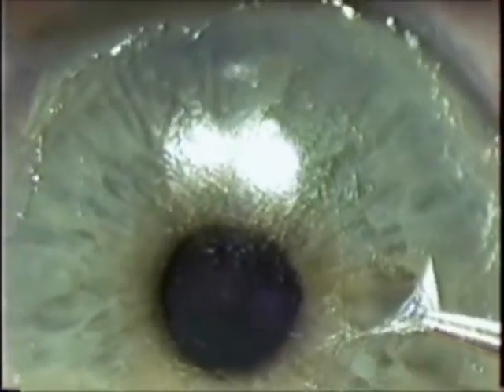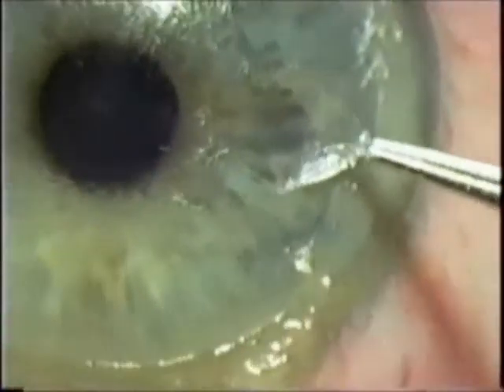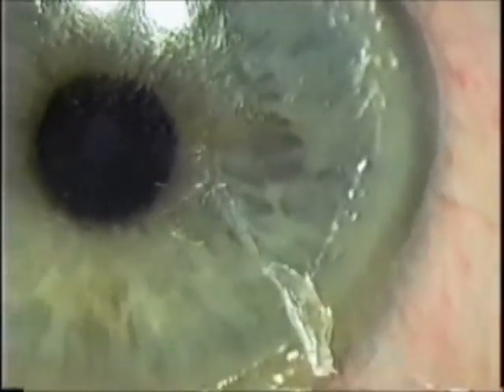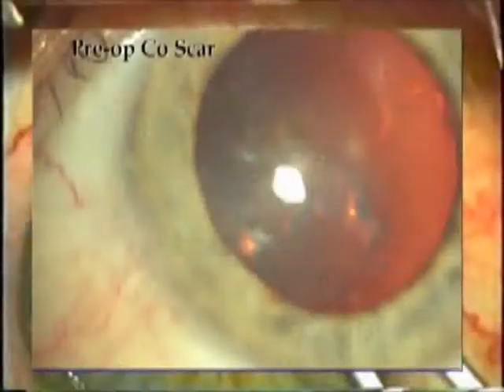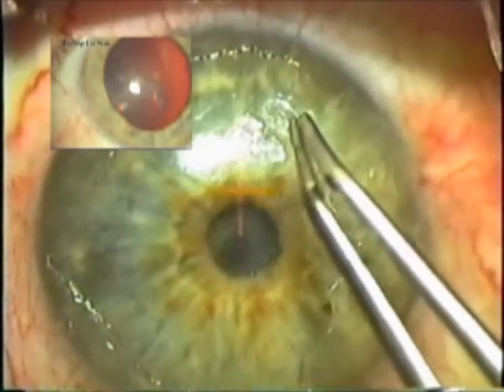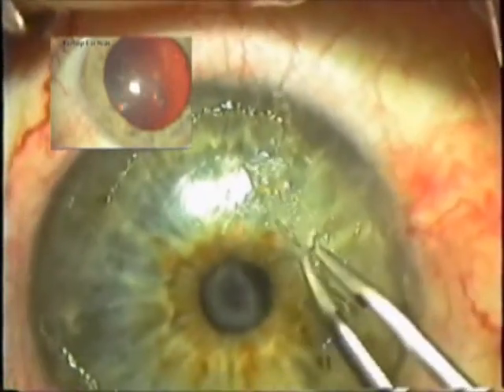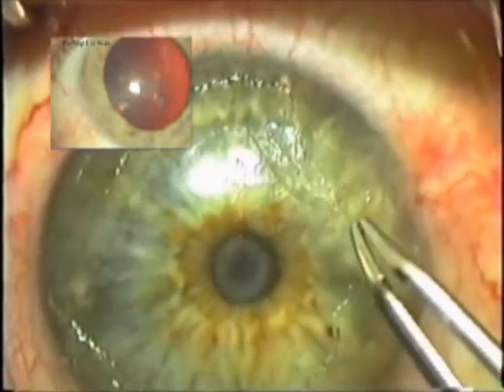For cases of sub-epithelial scarring, these patients can undergo scar peel right under the laser, gently pulling the entire scar so it is removed completely from the normal cornea, followed by refractive photoablation. In cases of more prominent scars, as long as they are superficial to Bowman's membrane, we can still peel them off using the lamellar anatomy to our advantage by creating a resistive guided technique, pulling vertical and away from the central cornea.